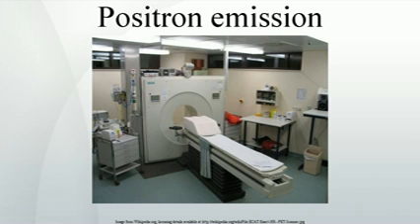Because PET imaging is most useful in combination with anatomical imaging, such as CT, modern PET scanners are now available with integrated high-end multi-detector row CT scanners, so-called PET-CT. Because the two scans can be performed in immediate sequence during the same session, with the patient not changing position between the two types of scans, the two sets of images are more precisely registered, so that areas of abnormality on the PET imaging can be more perfectly correlated with anatomy on the CT images.